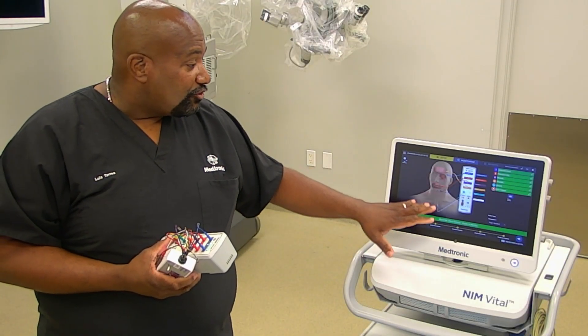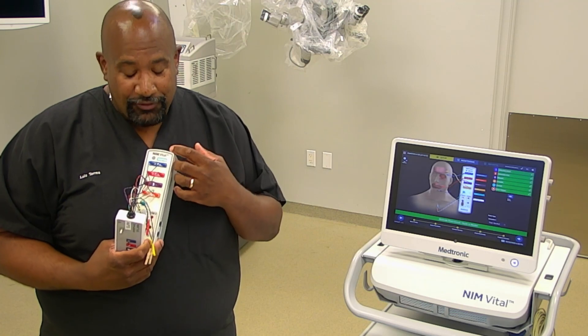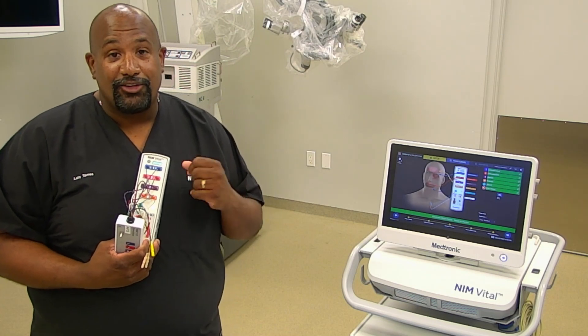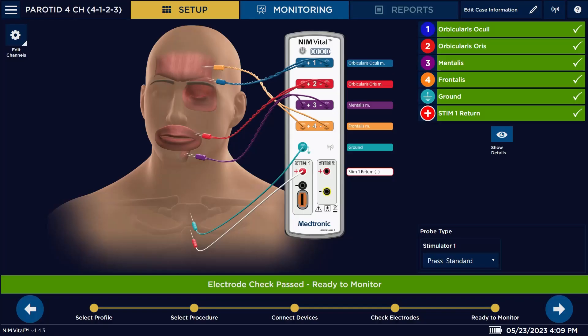You'll notice the different colors that we're using — all of those colors are also on the patient interface. If you don't have those electrodes plugged in, the number on the patient interface will flash to let you know they aren't connected. Once you connect those, they automatically go solid to let you know everything is connected. You'll also notice here on the screen everything will go green. Once everything goes green, you're just going to hit the arrow to go to your next procedure.